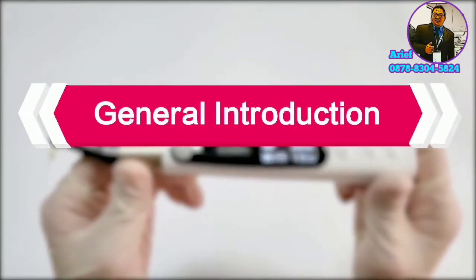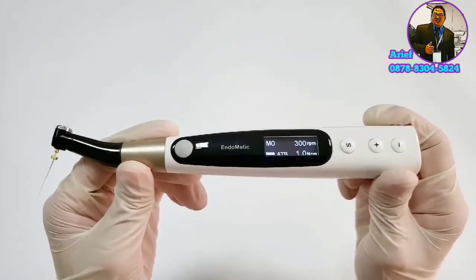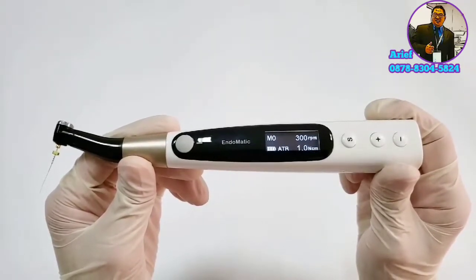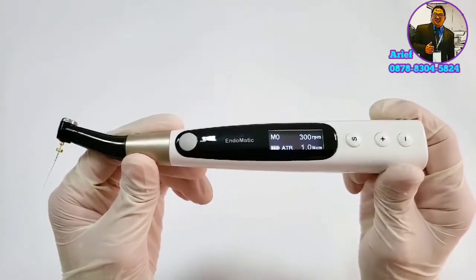Hello everyone, today I would like to introduce Woodpack's new endomotor, Endomatic. Endomatic is a full-functional endomotor. It's integrated with Apex Locator function and presets all market-famous file systems inside.